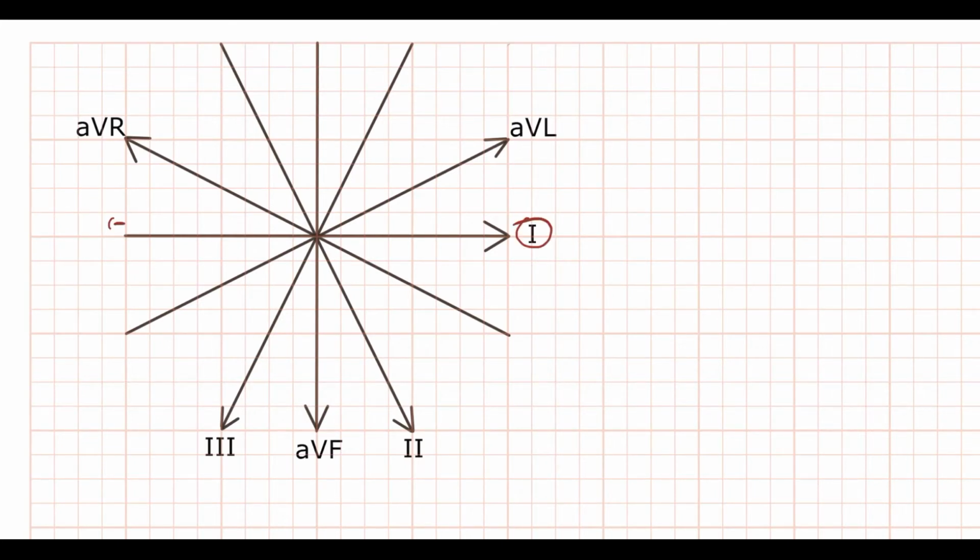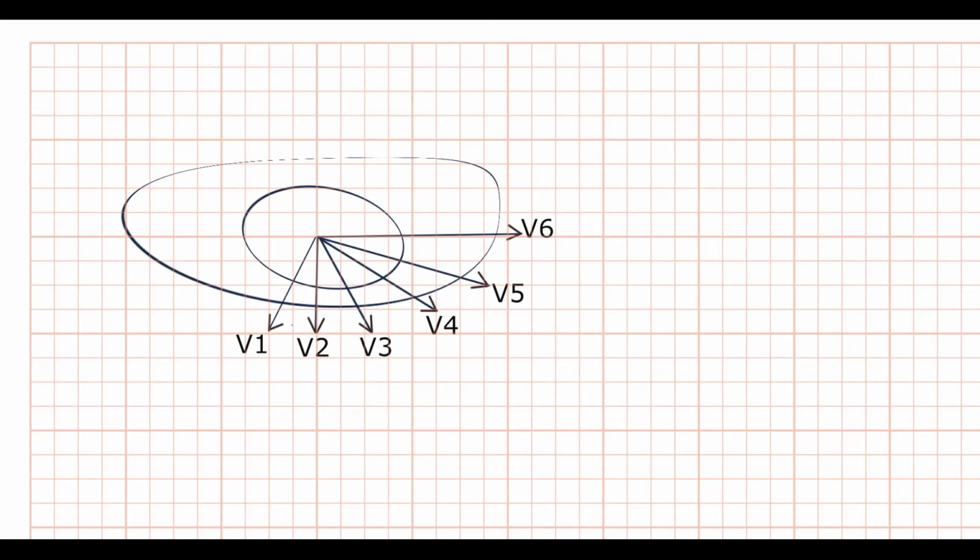There is negative electrode, there is positive electrode. Positive electrode is marked by an arrow, and heart electric activity that we see on ECG as first lead is registered only by positive electrode. Or for example, precordial leads. There is V1 lead that is formed by electric center of the heart and positive electrode that is marked by an arrow. And heart electric activity that is represented on ECG as V1 is depicted by this positive electrode. This concept is essential to remember.